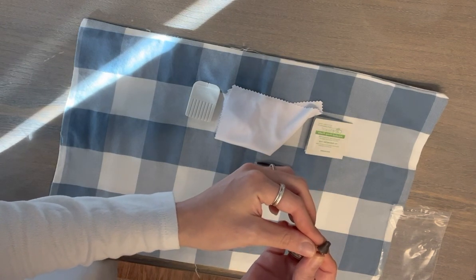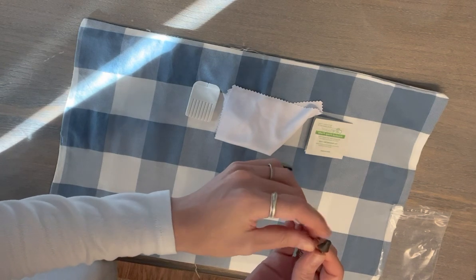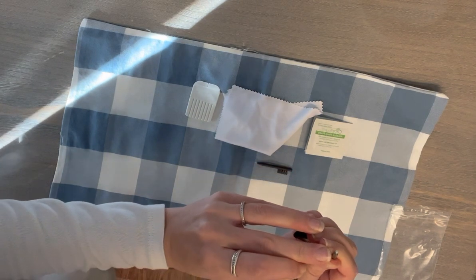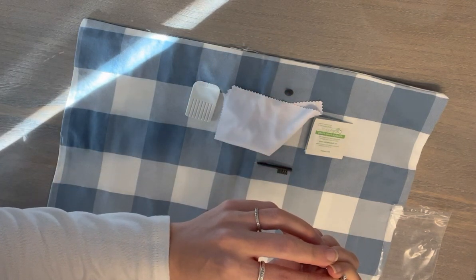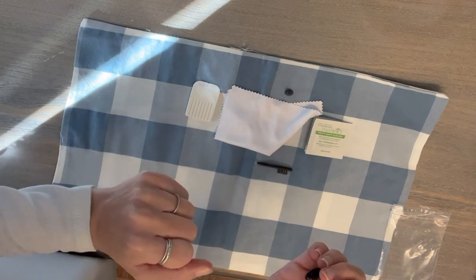If for whatever reason your hearing aid is not working and you know it is charged and you have cleaned it, underneath this dome is a filter. This little white filter can get clogged with wax. It is meant to protect the receiver from wax, so its job is to collect wax. If it is full, there will be no sound, so you would have to change the filter.